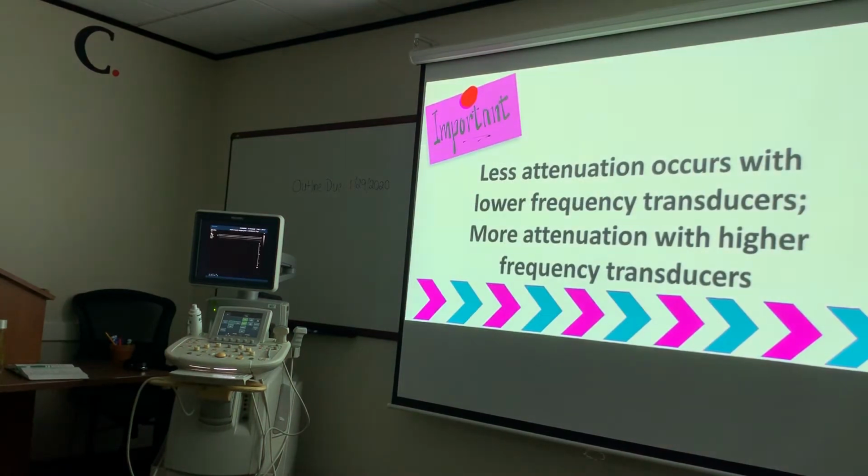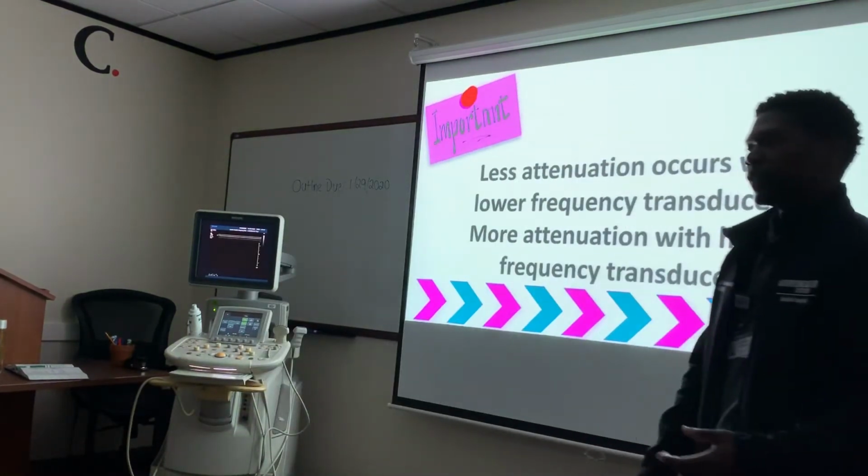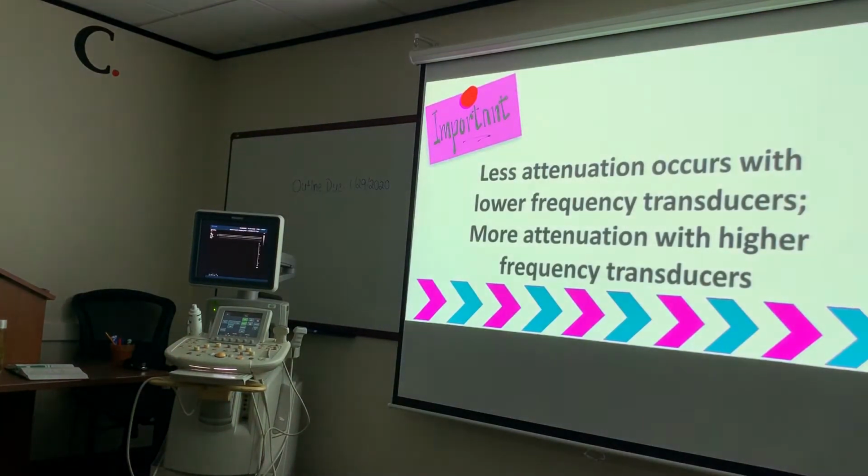Okay? Guys, remember, less attenuation occurs with lower frequency transducers, right? Less attenuation occurs with lower frequency transducers, and more attenuation occurs with higher frequency transducers, okay? So higher frequency transducers, they're gonna lose energy faster than lower frequency transducers.